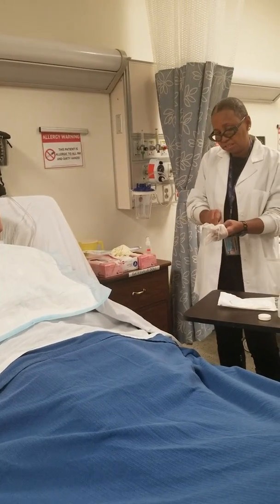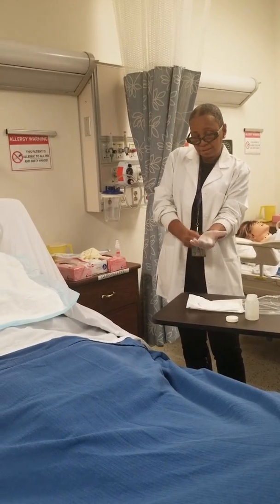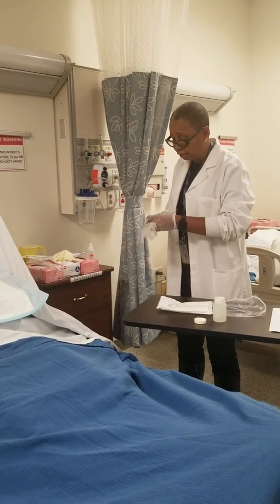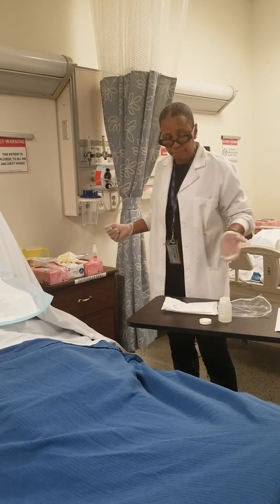I wonder if she's gonna stay sterile. Can the teacher do it? Because I can't. If you break sterility, what are you gonna tell us? I broke sterility. I would get a new pair of sterile gloves. Absolutely, that's what I'm gonna tell y'all. Trying to make me perfect.